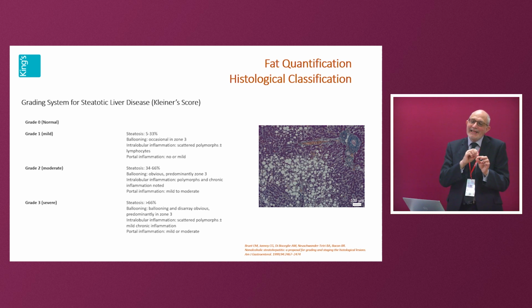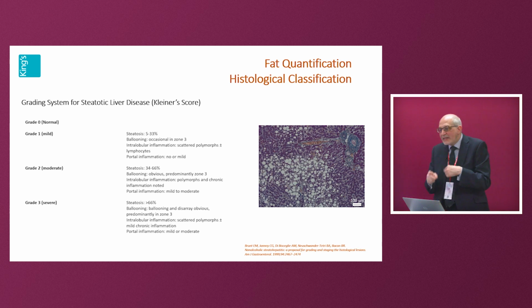We're seeing this with fibrosis, with shear wave elastography, 2D. Trying to put it into a compartment is difficult, but do you need to be in a compartment? You just need to know where it is on that scale. And same with fat, you just need to know where it is, and if you're treating it, is it going in the right direction? Okay, so this will change.